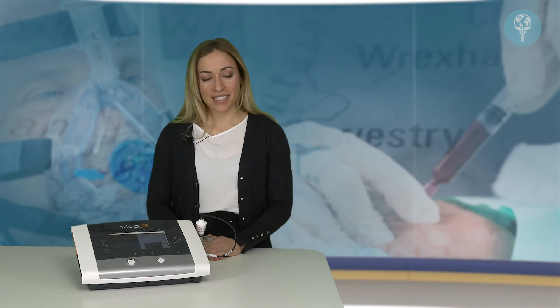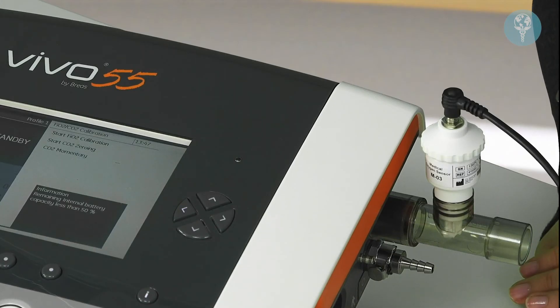In summary, we've just covered how to set up the FiO2 sensor, so you'll now be able to monitor what the fraction of inspired oxygen is that you're delivering to your patients.